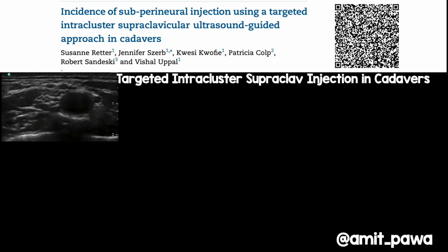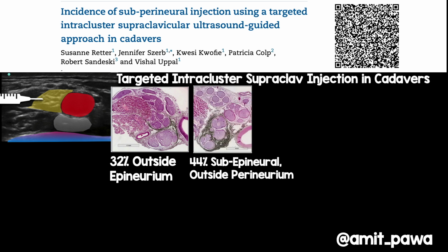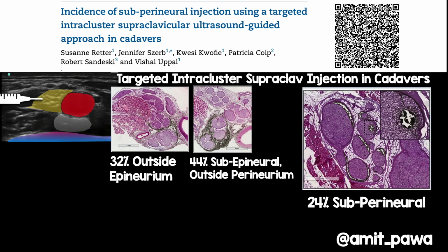So in this study on cadavers, they did targeted intracluster supraclavicular injections. This is literally putting the needle inside that supraclavicular brachial plexus and injecting over there. When they did that, they found that in 32% of cases there was injection outside the epineurium. So that's good, but more worryingly, in 44% of those cadavers there was a subepineurial injection, but it was still outside the perineurium. But in 24% of cases, that targeted intracluster injection was associated with subperineural injection.